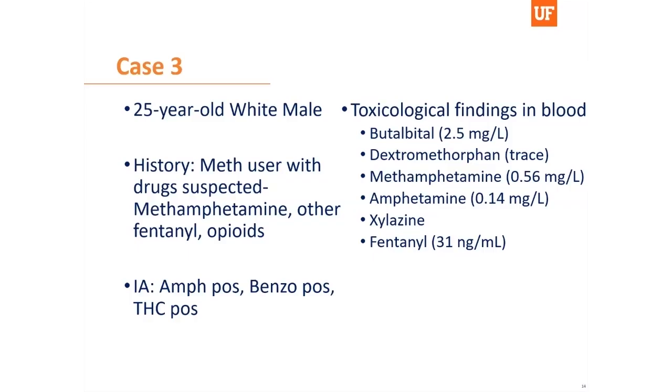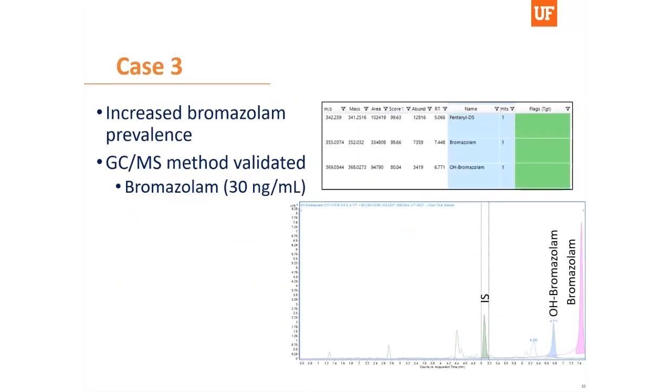After reviewing the results from our testing, it was observed that the presumptive positive for the benzodiazepine was not confirmed by our confirmatory testing. Through our out-of-scope benzodiazepine PCDL, we identified hydroxybromazolam and bromazolam. From the chromatogram on the right, I wanted to highlight the chromatography that is sometimes observed for our out-of-scope compounds. Since the method is not optimized for these compounds, the chromatography is not always ideal. For bromazolam and hydroxybromazolam, they have peak tailing, but this is also observed for other benzodiazepines, such as alprazolam.